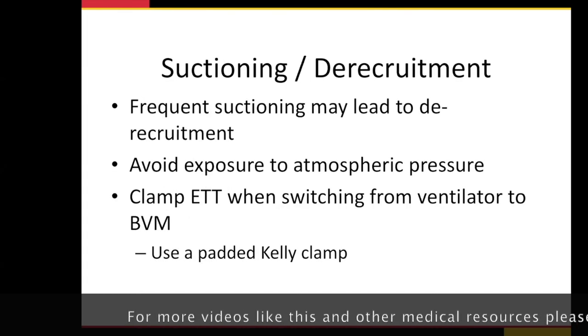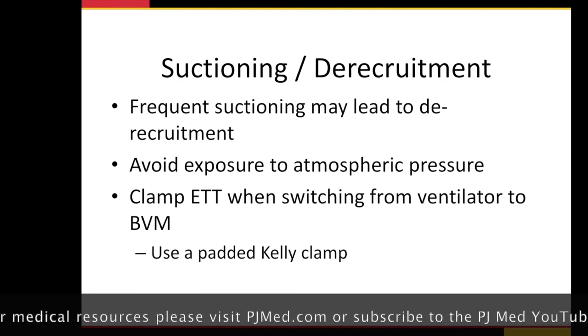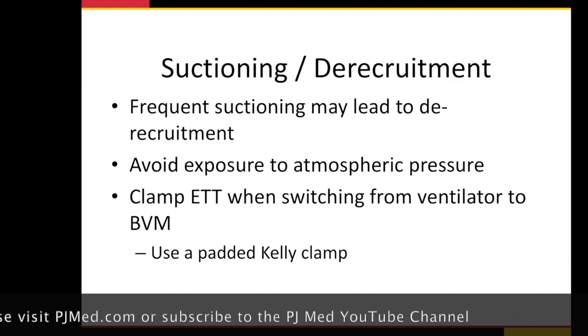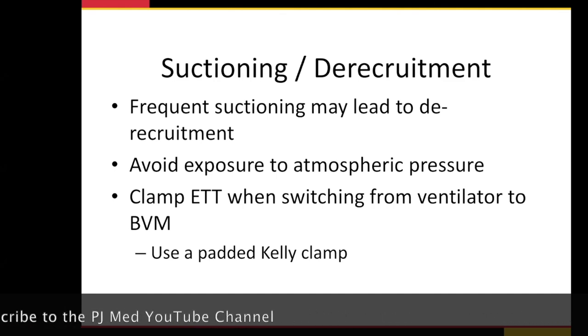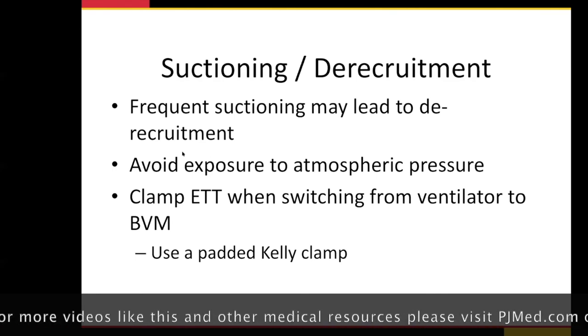One other thing you're potentially going to be tasked with, I could see this happening: what if you suction the patient? We're really not trying to do this with the COVID patients. We do not want to do anything that's going to aerosolize, so we try to limit suctioning. We're not doing bronchoscopy on these patients. But if you need to, here's the key. A couple of things are important to do.